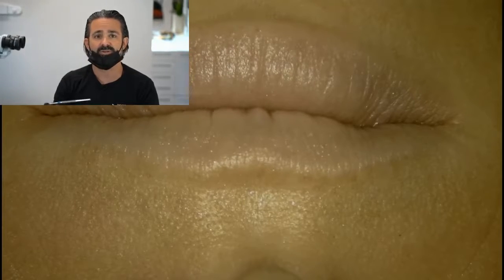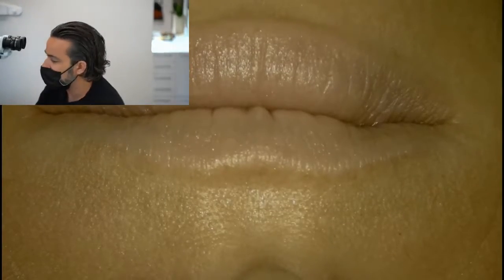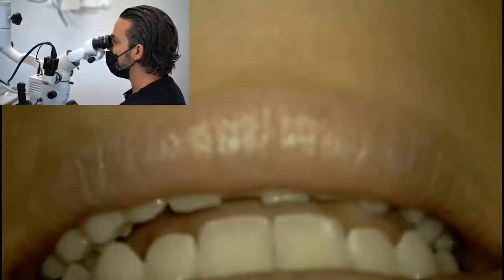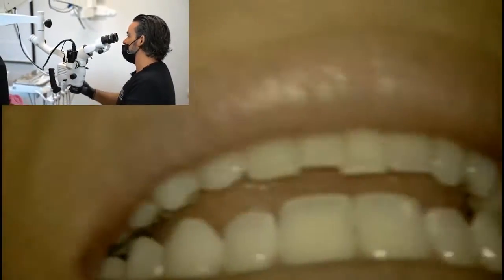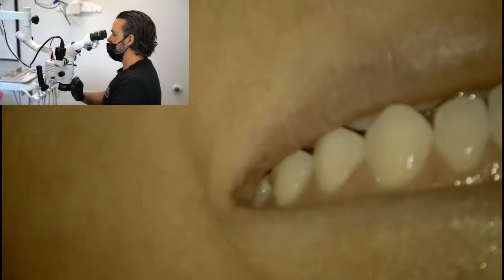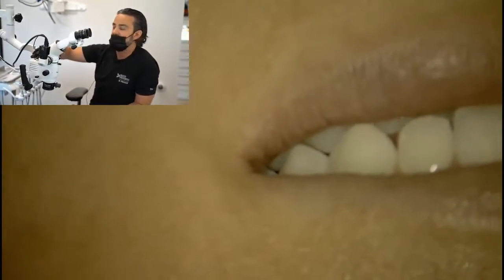The other thing with surgery, if you really want to know these details, I really turn down the power. When you're doing a surgery on something, you tend to actually get really close, down to like the 200 range. There's not a lot of splashing, and I'm really dialing in, and maybe her head's cranked or something like this. And when you get close, you generate a lot more heat with the light. So I really will have it down on a low setting.